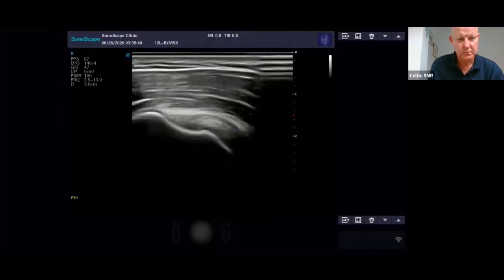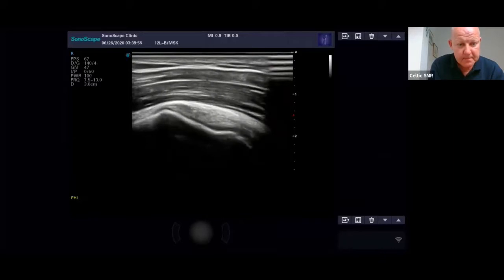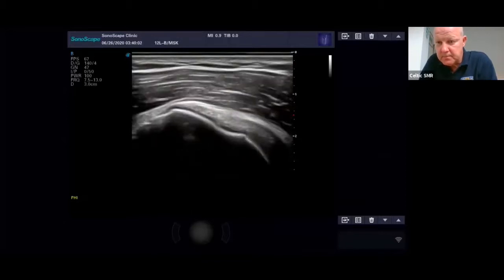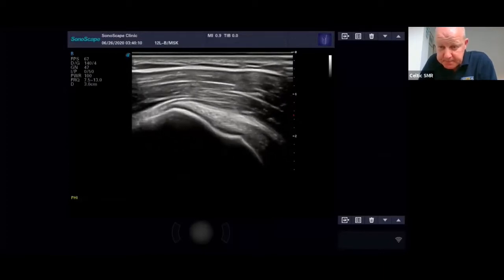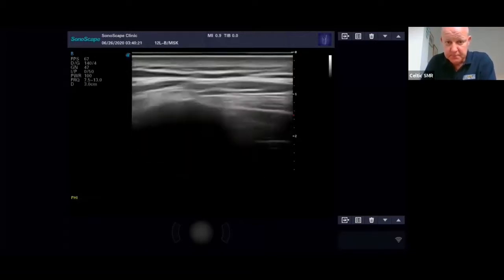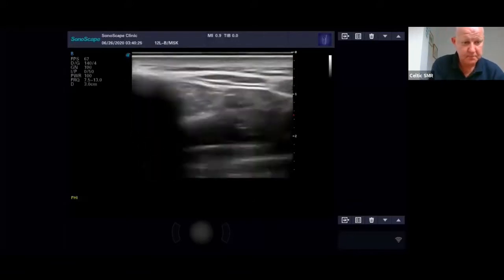Any others? Don't forget to constantly tilt the probe to rule out anisotropy on the insertions there. If you've got any tears, obviously measure them. If it's a chronic tear, what the surgeons will probably want to know is, is there any sort of muscle atrophy, any fatty infiltration to the muscle, which you can look at from the back.